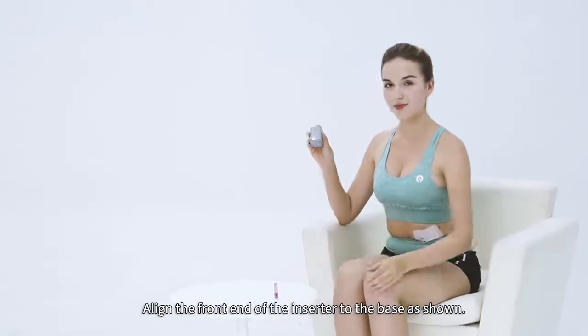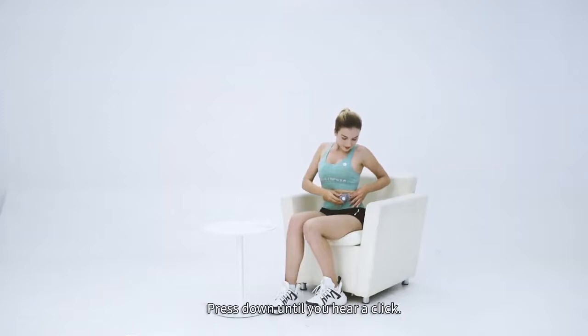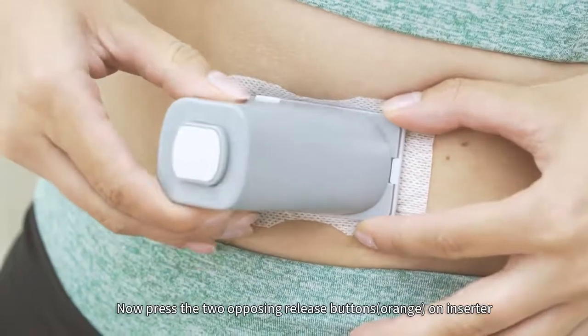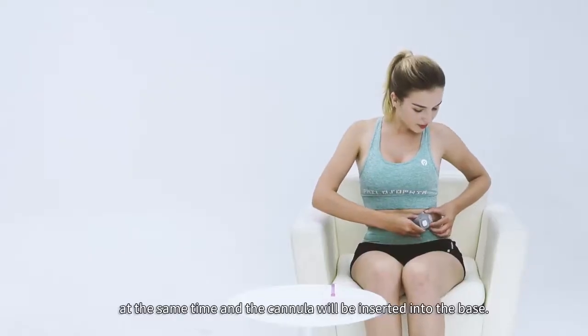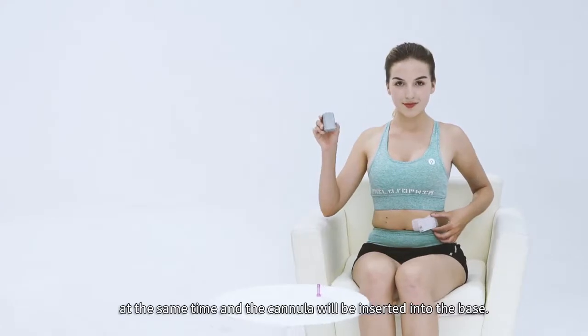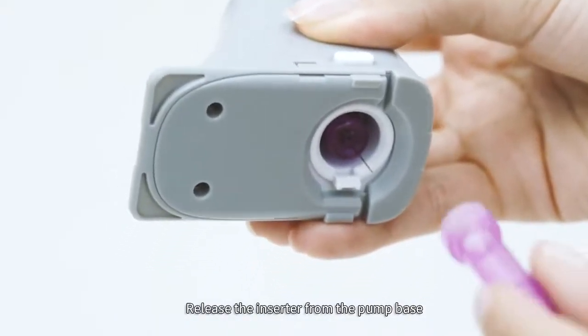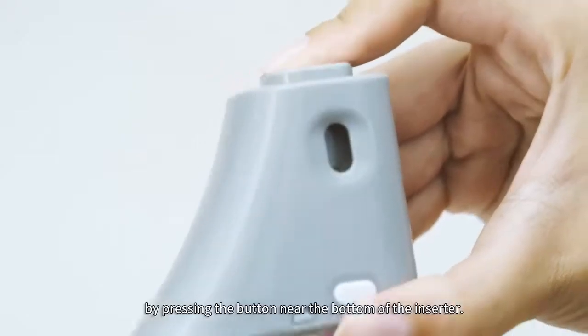Align the front end of the inserter to the base as shown. Press down until you hear a click. Now press the 2 opposing release buttons, orange, on the inserter at the same time, and the cannula will be inserted into the base. Release the inserter from the pump base by pressing the button near the bottom of the inserter.